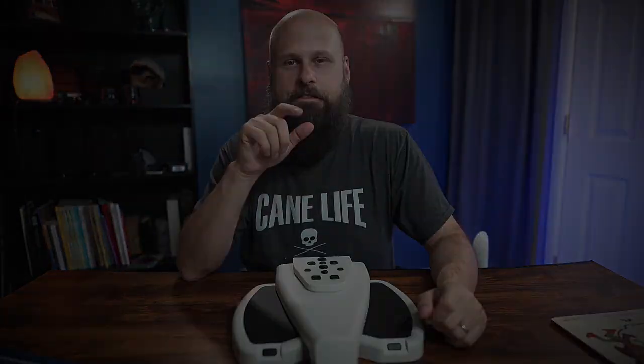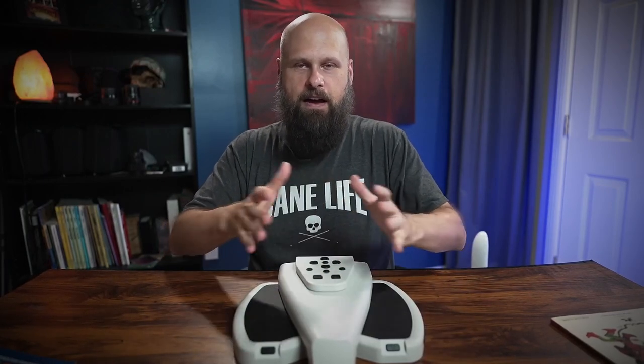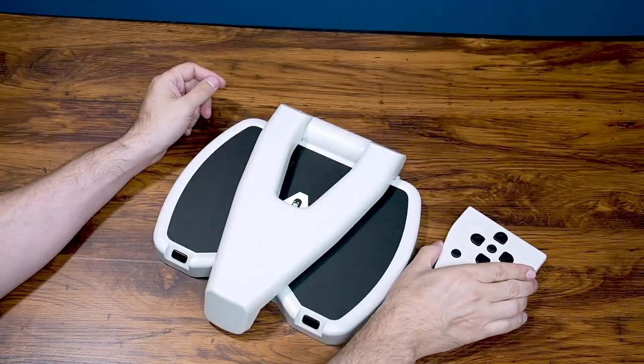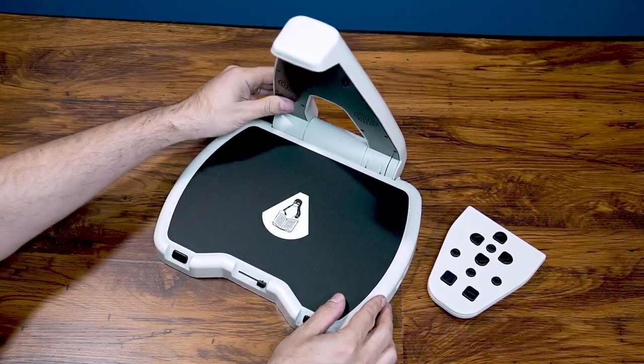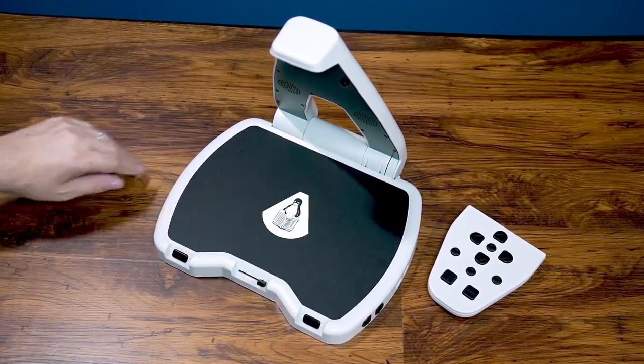Now the battery — 15 to 20 hours of battery life on this device, very impressive. A lot of that has to do with the fact that whenever the arm is down the device kind of goes to sleep. It's always ready for you whenever you need it — you just lift the arm up and you can use it, but then when you're done put the arm down and it goes to sleep, saving your battery.